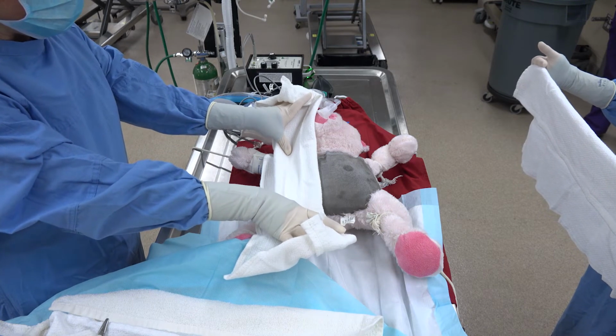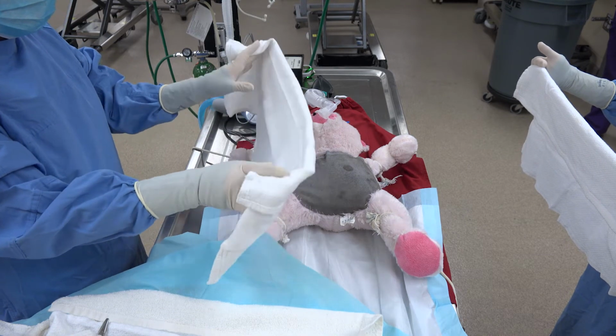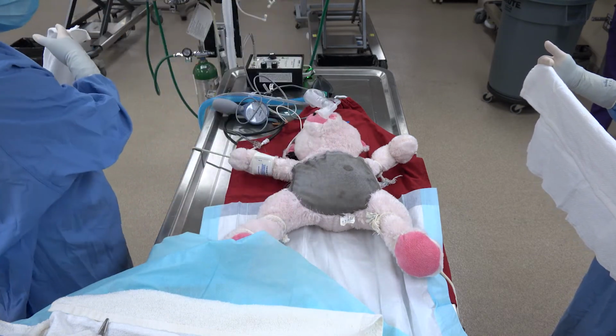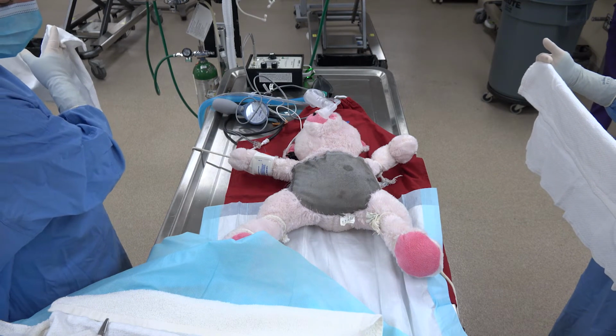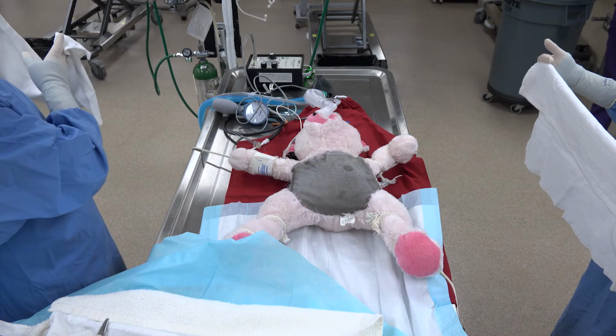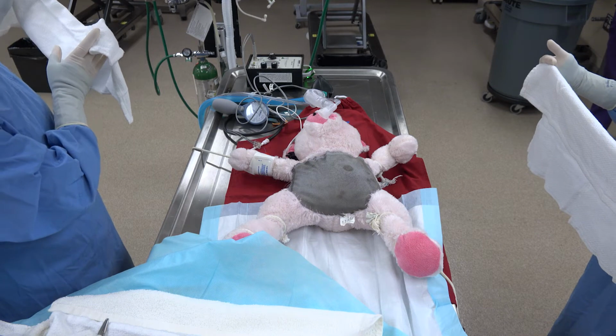So if you think, oh no, I pulled it too far and now I'm outside of my prepped area, this towel then gets thrown away and you get a new towel, all right? It's completely contaminated. Now this happens sometimes. It happens sometimes because someone came by and a gust of air blew it off. It sometimes happens because you just weren't paying attention, but it happens.